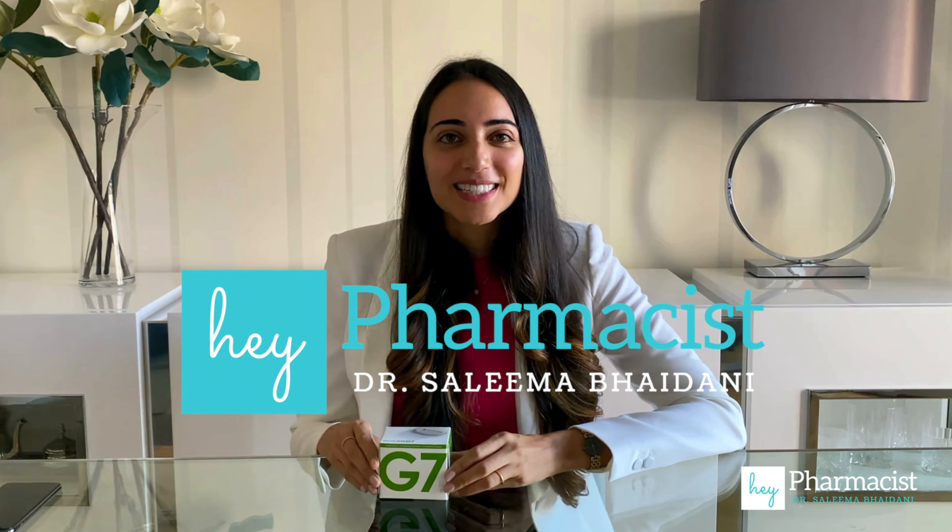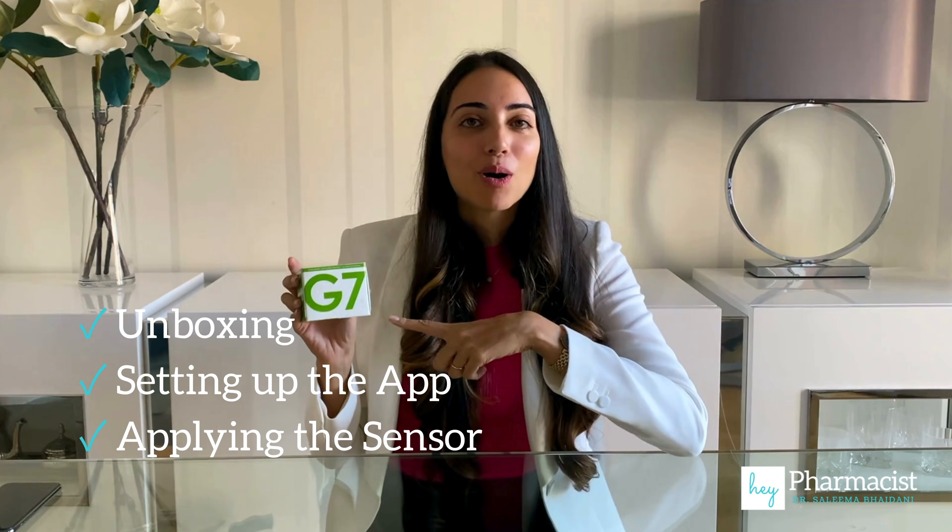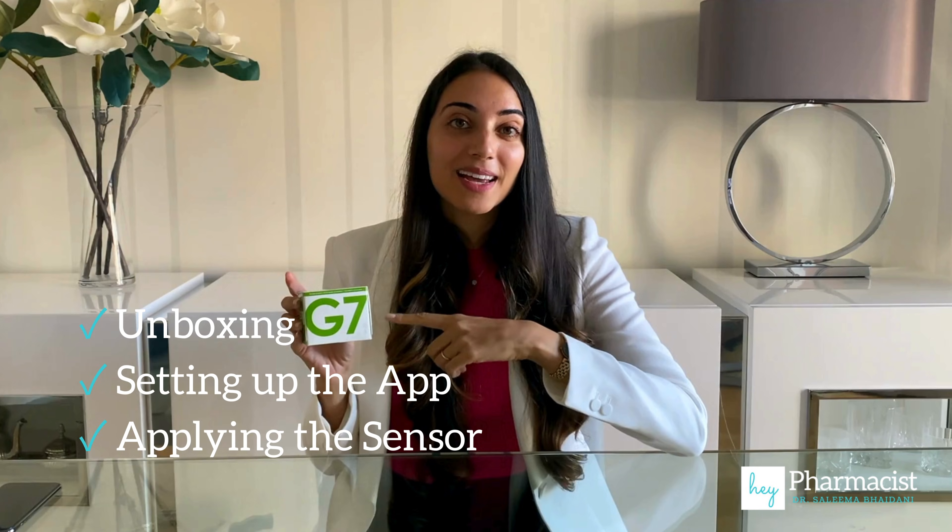Hey pharmacist, welcome back to the channel. Today we're going to be doing an unboxing of the Dexcom G7. I'm also going to be setting up the app and applying the sensor to my skin. I've never done this before, and the reason I did that is so that we could go through the patient journey together of what they may experience the first time they open their Dexcom G7.